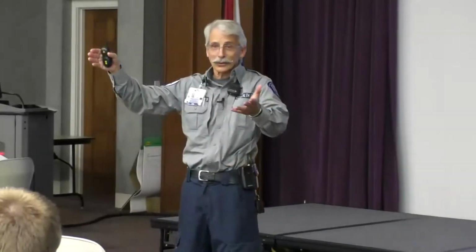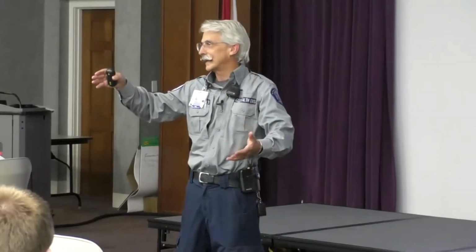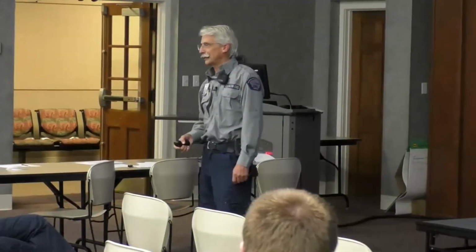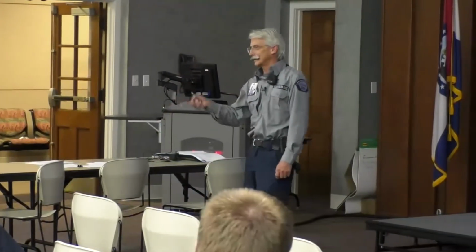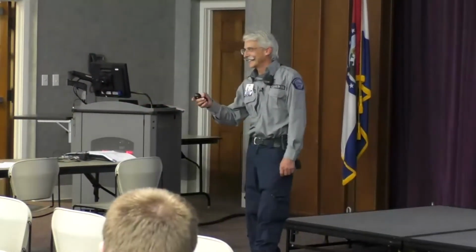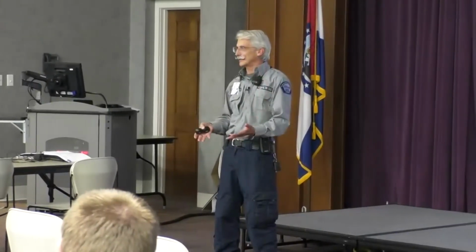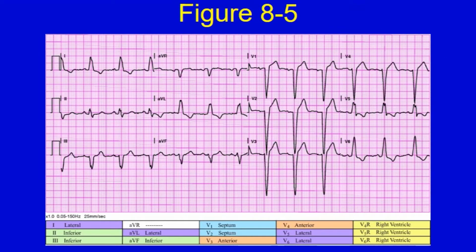Nice try. Those are great guesses, and there'll be some people who'll tell you that's right. It's not. The V stands for unipolar. It's from the Latin side of the world. It's all the unipolar leads.